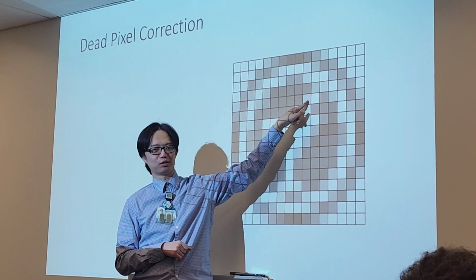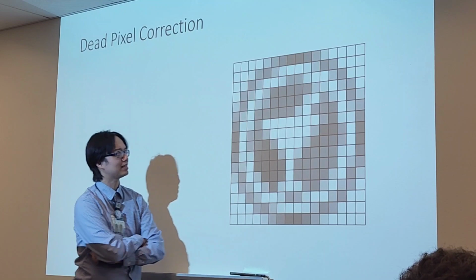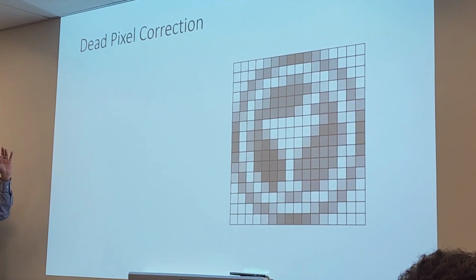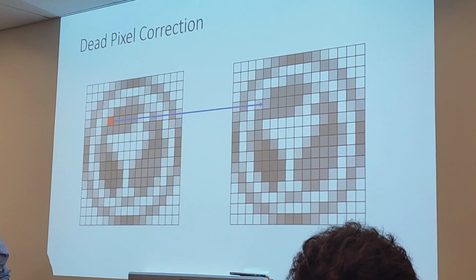I think the spatial resolution is so poor you can't see the olive properly. Where is the dead pixel? It doesn't look like there's a dead pixel here, right? Everything looks correct.